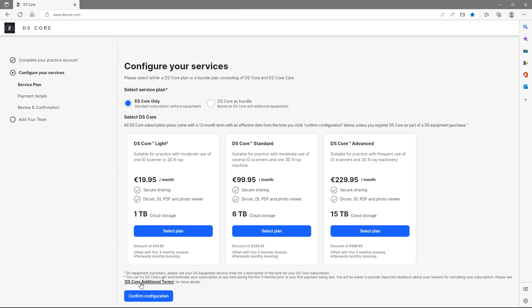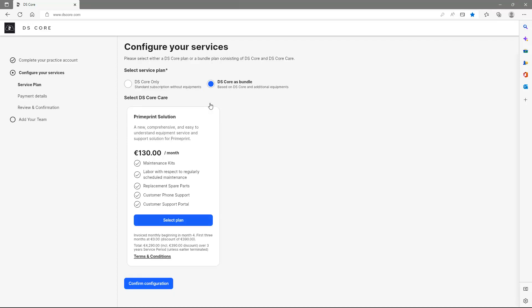In our case, we select the second option, DSCore as bundle. This is a new comprehensive, integrated, and easy-to-understand service and support solution for your Dentsply Sirona equipment. As soon as we roll out further Dentsply Sirona solutions to the market, you will find them in this section.